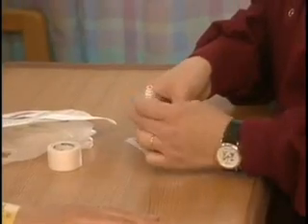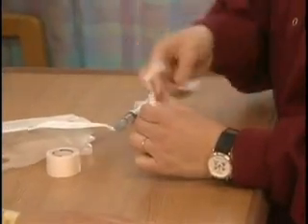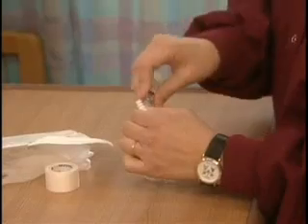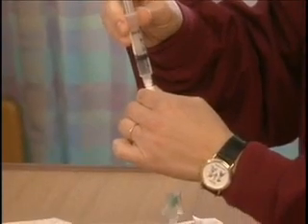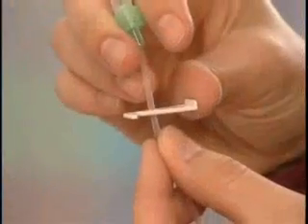You might want to clean that cap first. Now you can clamp the tubing.